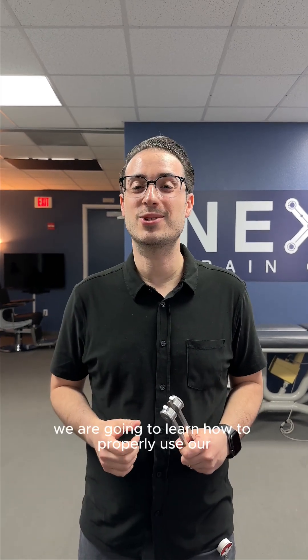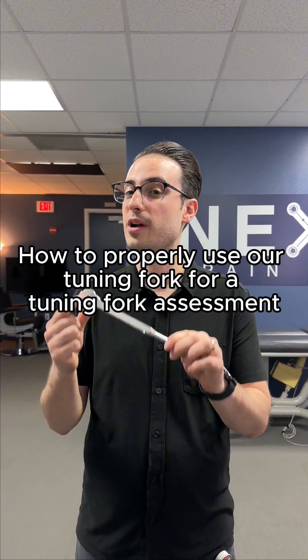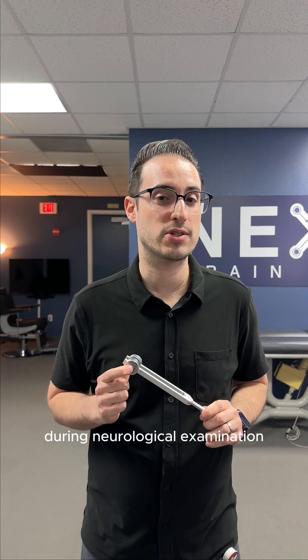Hi everyone, Dr. Perman here. Today we are going to learn how to properly use our tuning fork for a tuning fork assessment during neurological examination.